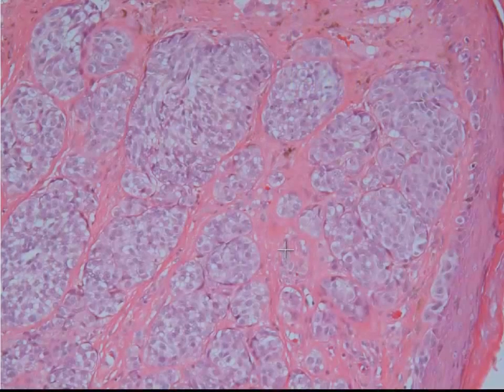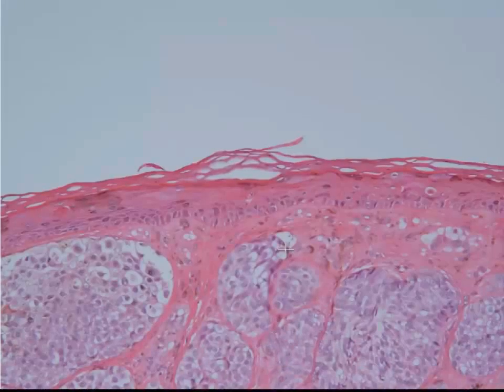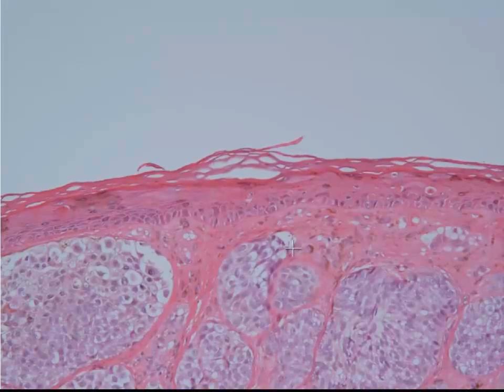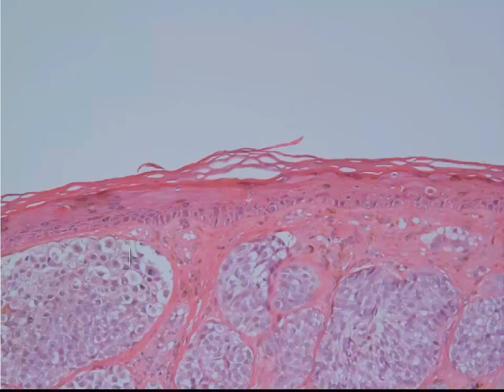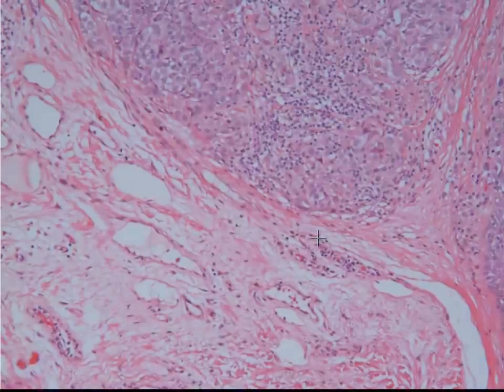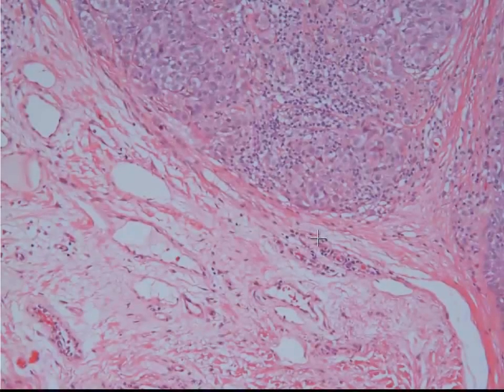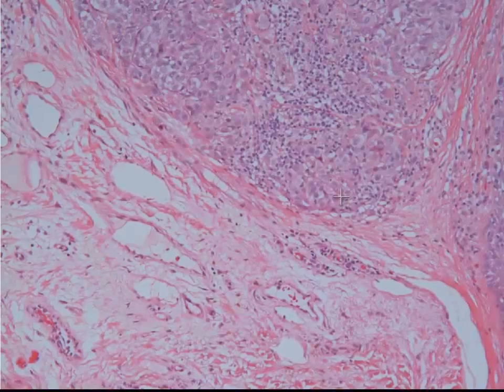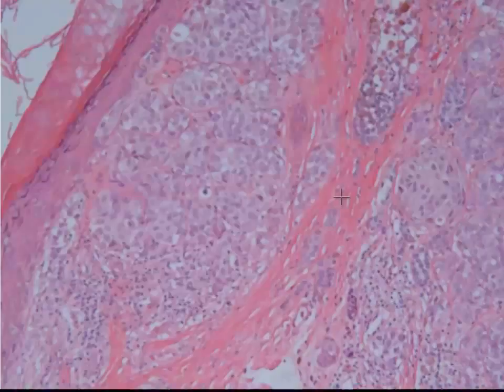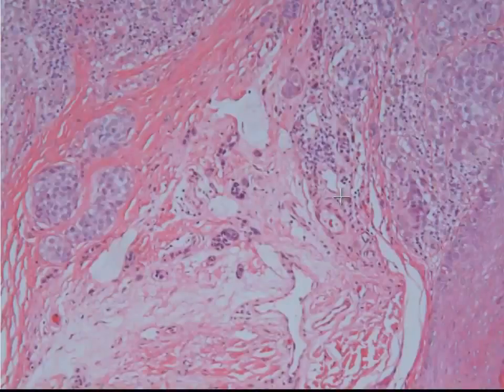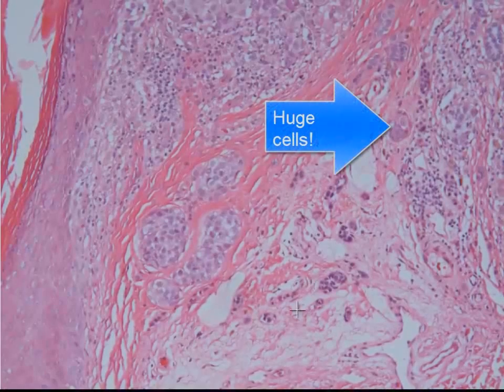In addition, they have irregular and pleomorphic nuclei. One of the finer things that's harder to recognize is that they actually don't mature. When we talk about maturation, we're talking about the size of the nucleus and cell. At the top they are rather large, and as we move deeper into the dermis, they stay rather large — they're not getting smaller, or maturing as we say. Because of this, we know this is a good sign that we're dealing with a melanoma.